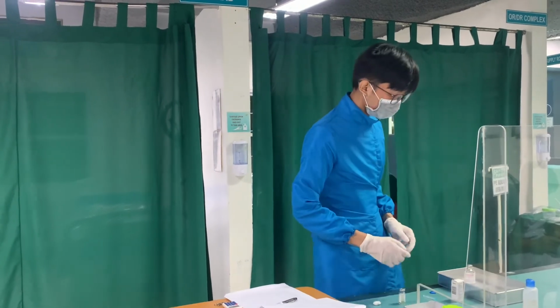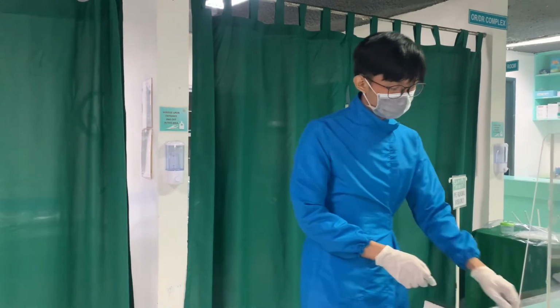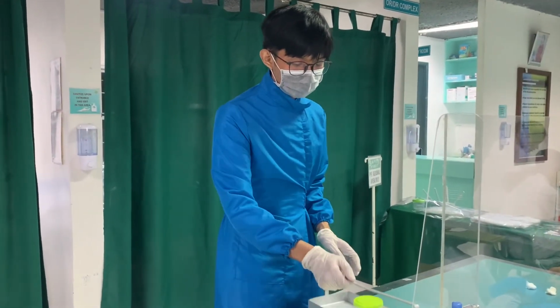Recheck the label with the MAR. If a multi-dose vial is being used, label the vial with the date and time opened, and store the vial containing the remaining medication according to the facility policy. Lock the medication cart before leaving it. Perform hand hygiene and proceed with the administration based on the prescribed route.